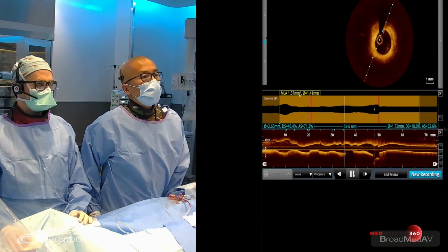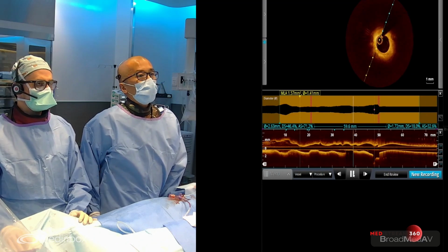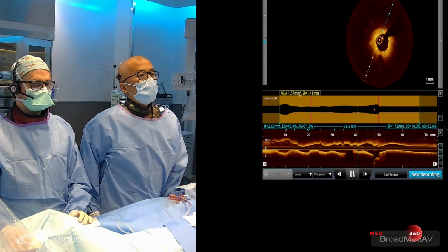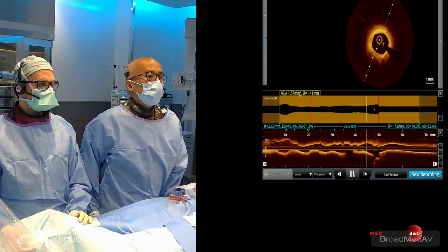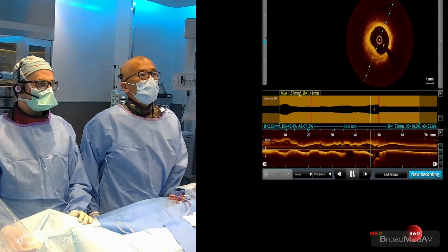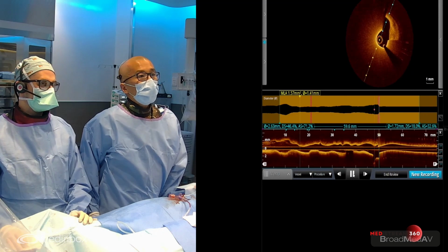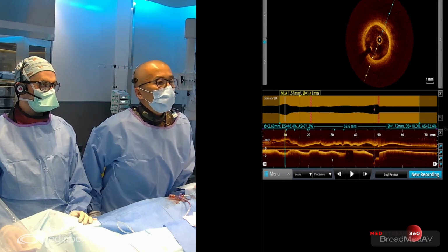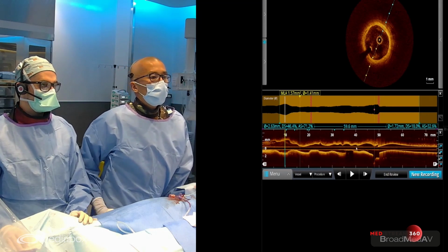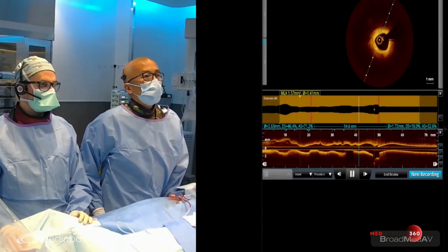We're coming out of the stent now, and again, you're seeing a lot of calcium. There's a fair amount of calcium in the medial aspect of the artery. I think it was 2 o'clock and 7 o'clock. And again, as we're nearing the ostium of the RCA, it's fibrocalcific, more fibrotic, closer to the ostium, but towards the 40 millimeter mark, you can also clearly see around there, there's calcium, I think.